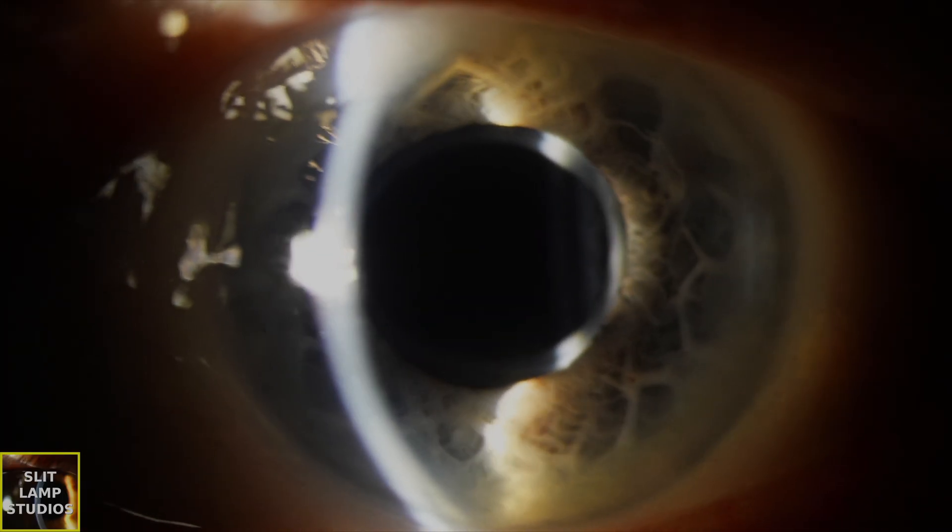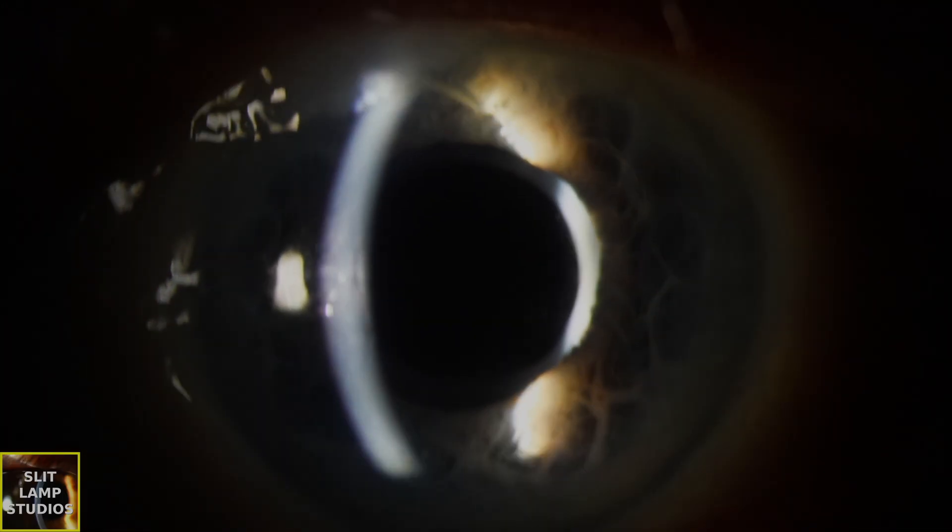Hypotony usually refers to abnormally low intraocular pressure, typically less than 6 mmHg, and this in itself can lead to structural changes in the cornea. This patient had an intraocular pressure of 4, and that was verified with Goldmann applanation tonometry.